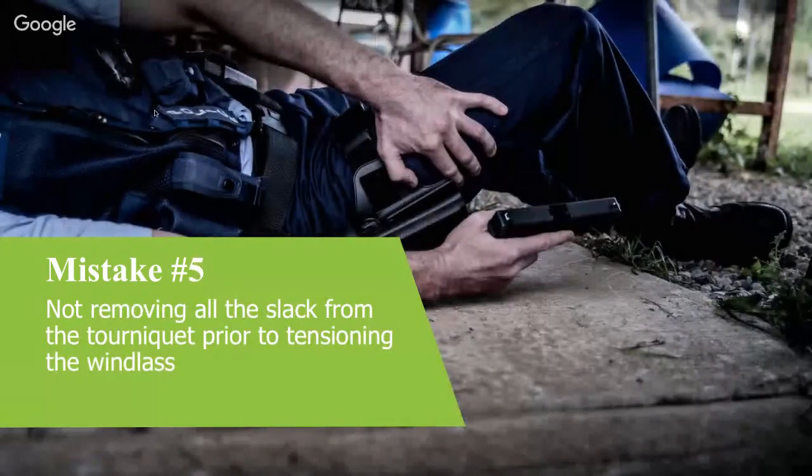Something that we see is not removing all the slack from the tourniquet prior to tensioning or turning the windlass. I think most people that have played around with tourniquets or put them on would see that if you don't take out all that slack, and they even say in the guidelines that you need to take out as much slack as possible. If you can still place 3 fingers between the tourniquet and the limb, then you haven't removed enough slack.